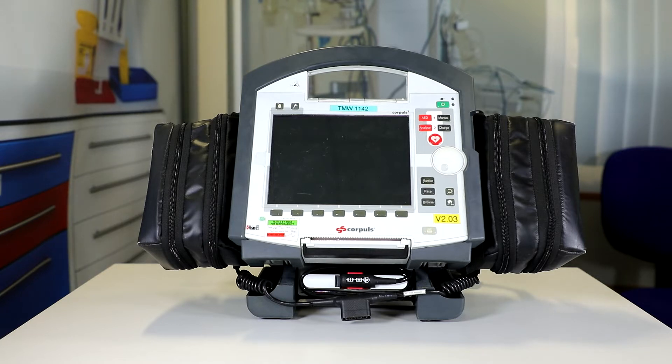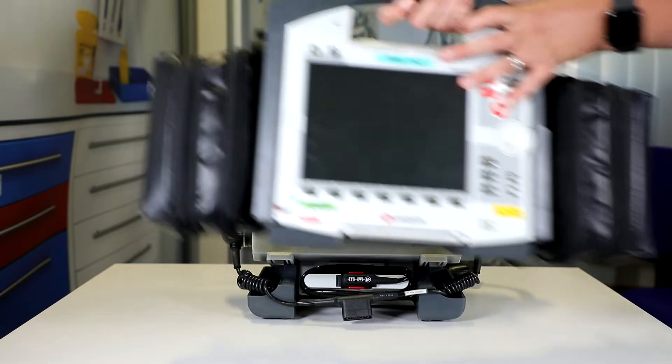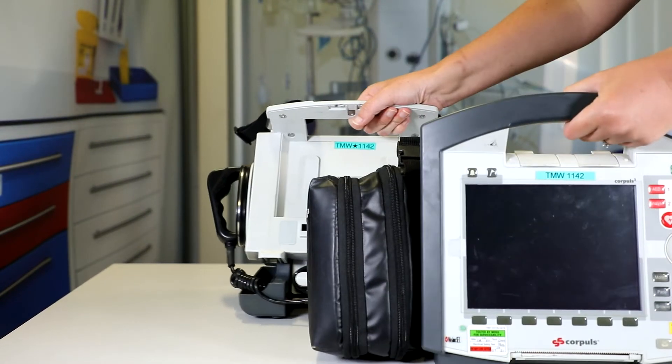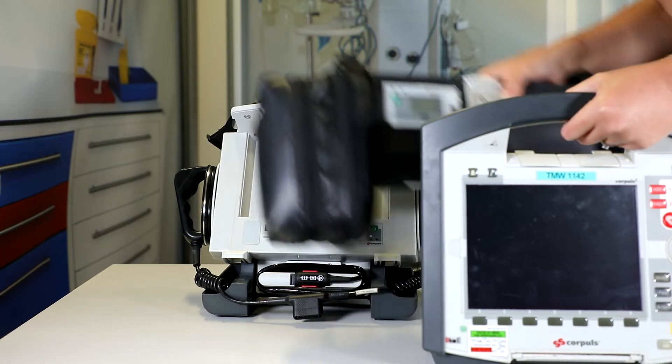The first thing we want to do is check that it is performed unplugged from the mains, so we can see that we're not plugged into anything. We're then going to split it down into three modular parts. To do this, we press the clips on the top like so, and as you can see I'm now detached from the defib, and then I'm also going to disconnect from the patient box like so.